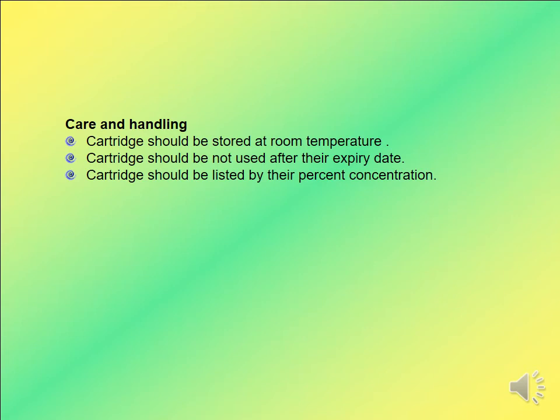All of this is listed within the cartridge, so it shows the concentration of the local anesthetic drug, the vasopressor, or another part that has been put within the local anesthetic solution.